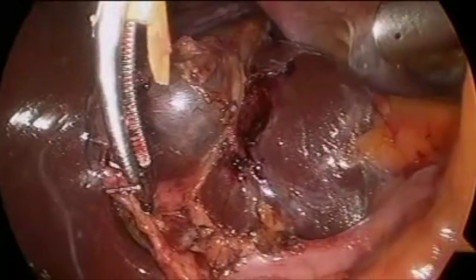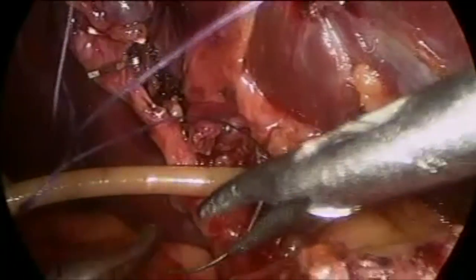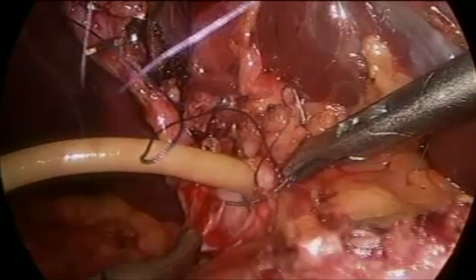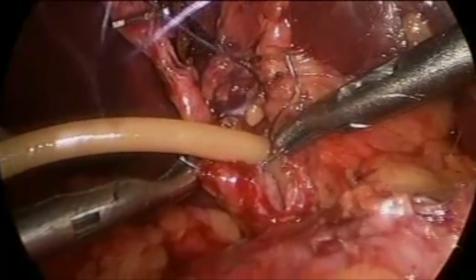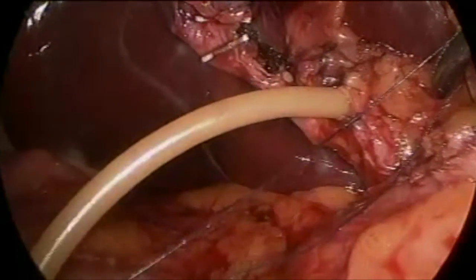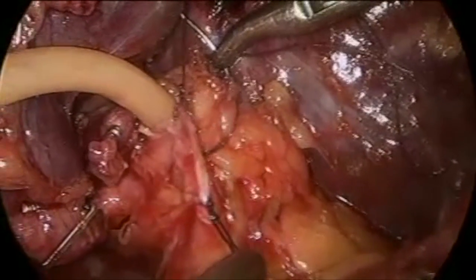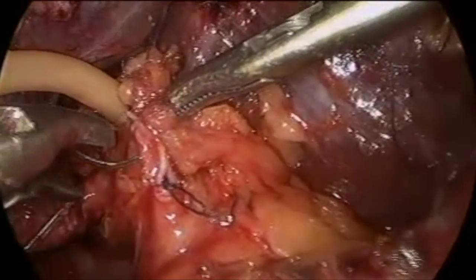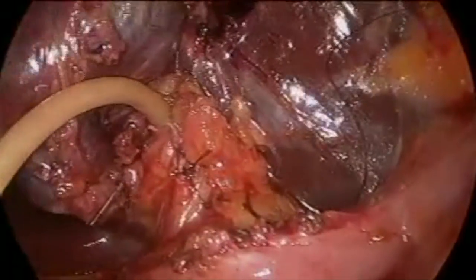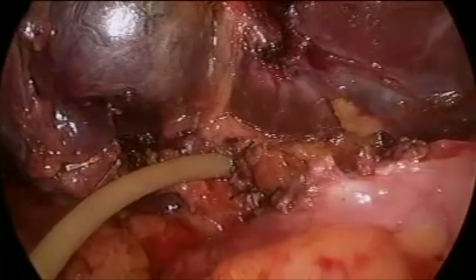After flushing out the duct several more times, a T-tube is introduced, cut, and prepared for insertion. It is then sutured in place using 5-0 braided absorbable sutures in an interrupted fashion, achieving a tight closure on the bile duct. A total of three sutures were required to close the choledochotomy and secure the T-tube in place. The repair appears sound with no obvious leakage around the T-tube insertion.